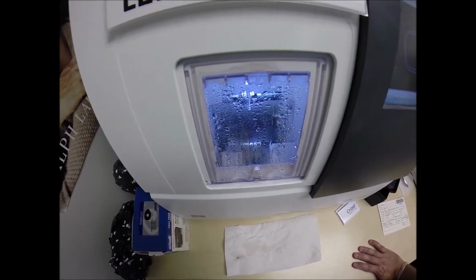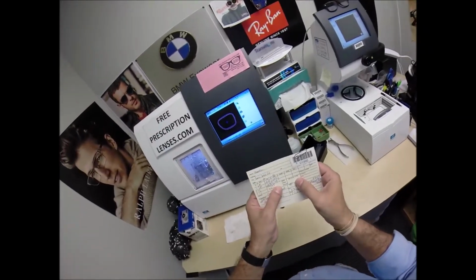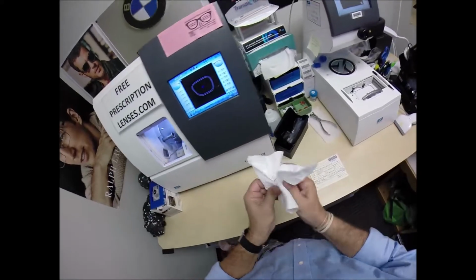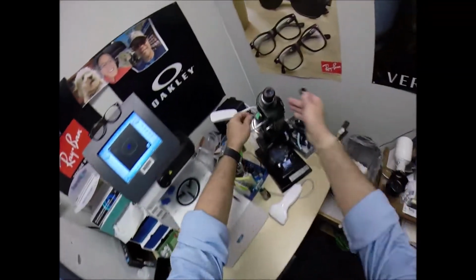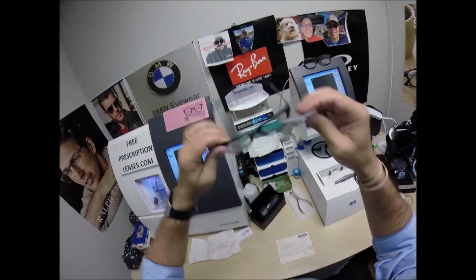Of course, you get a pair of free lenses every time with the purchase of any frame. I upgraded you to the thinner and lighter weight aspheric polycarbonate. Aspheric simply means not spherical, so these lenses are flatter. You don't get that ugly cosmetic fishbowl appearance. These are flat lenses designed to go into today's flatter curvature frames. Of course, it's going to go in there like that.